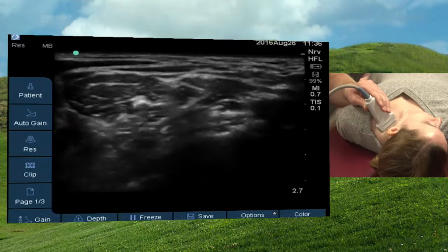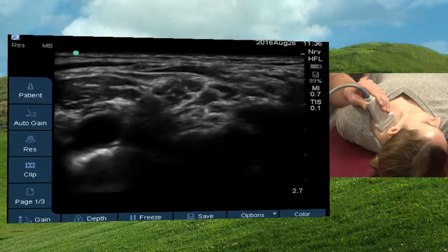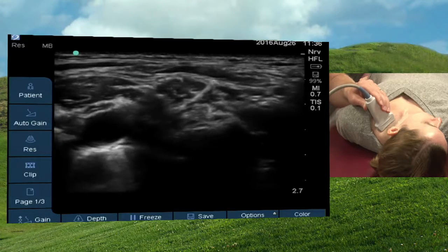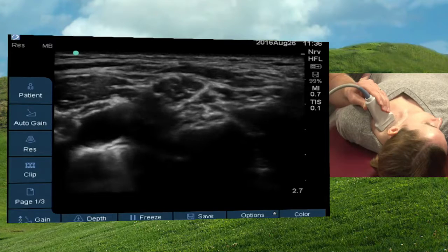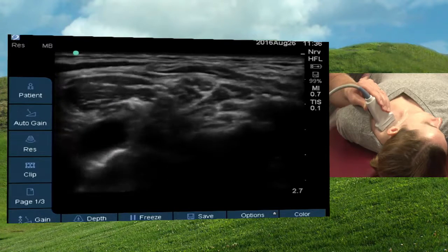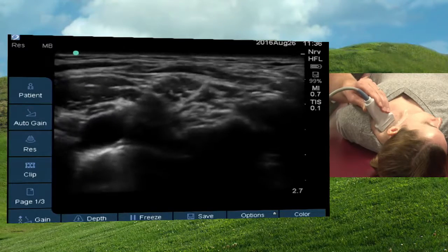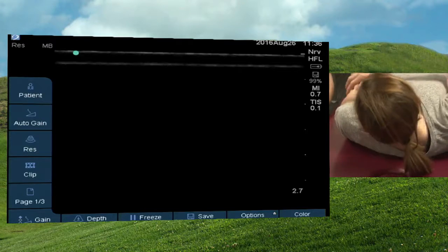If we wanted to do a nerve block that was a little bit more distal to the shoulder, maybe we could easily come down here and block these nerves. At this point, we're obviously past the roots and the trunks. We're more into the divisions and cords right here. It gets kind of murky. If we wanted to do distal elbow surgery or hand surgery, we could do an axillary nerve block.